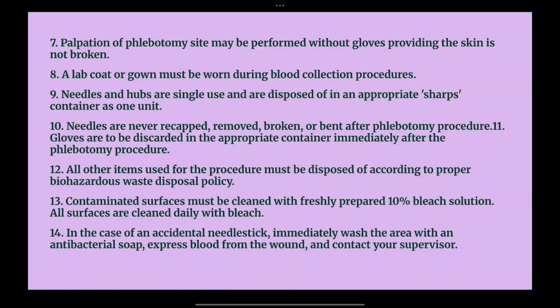If you have drawn the blood and you want to remove the needle, it should never be removed by hand or recapped. It should be directly put into the sharps container only. Don't use your hand, because of the chance of injuring your finger or hand with the patient's infected blood, which can cause cross contamination of the blood and diseases might spread.